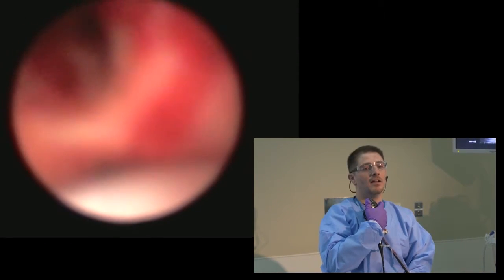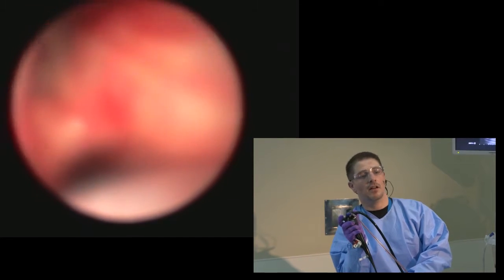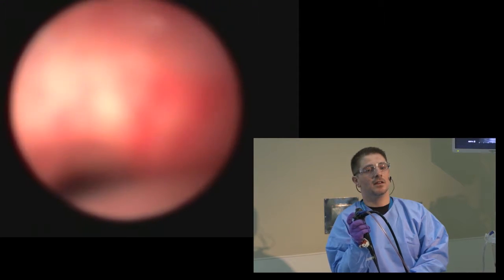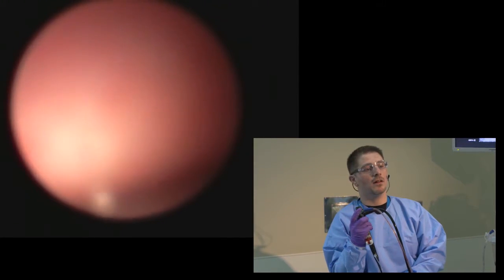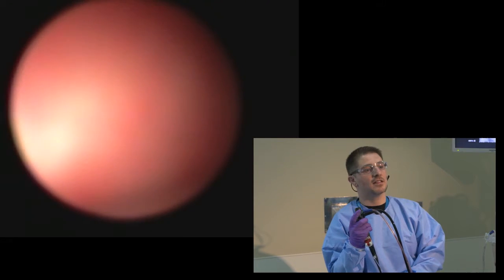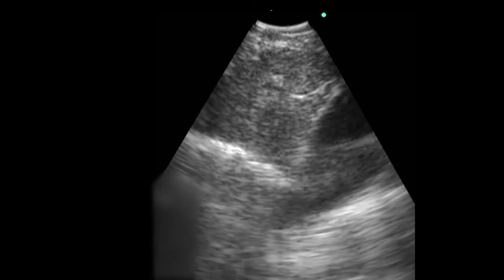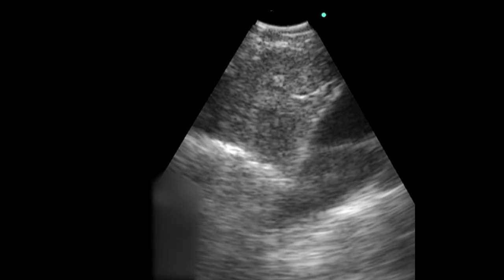As you see here, the main carina, you turn to get into the right main stem, you pass to the bronchus intermedius, and then you thumb down below the right upper lobe, and you can see here a big lymph node. The lymph node is square shaped, so the short axis and the long axis are the same, starting from the white border up to the other border. 11R in this situation is 16.4 millimeters.